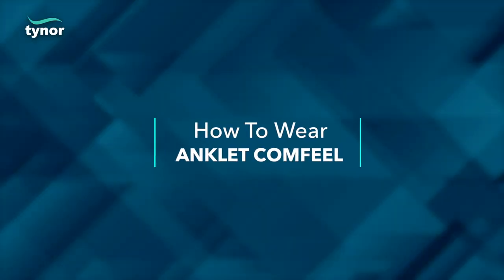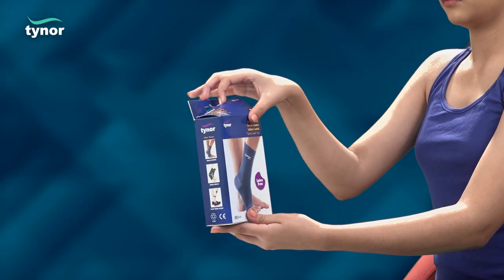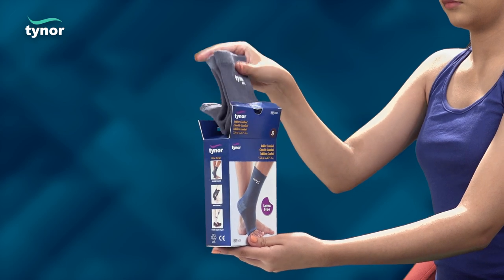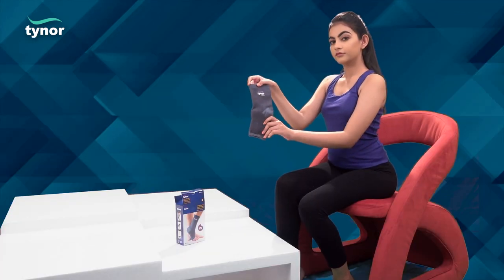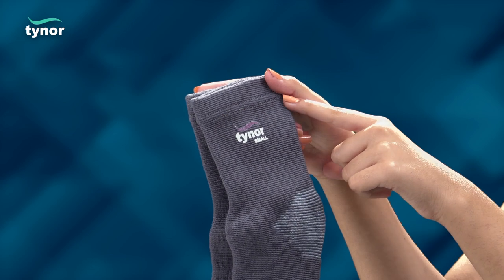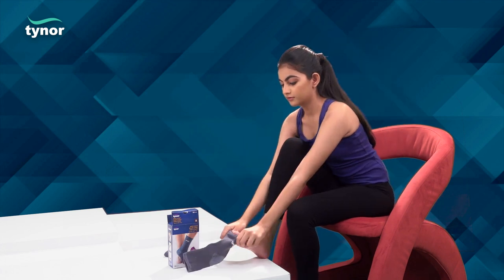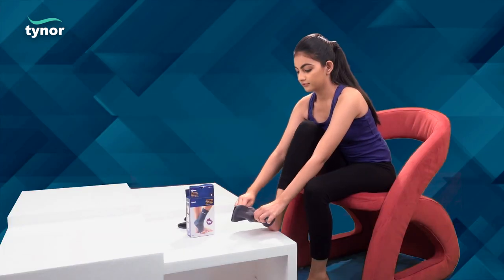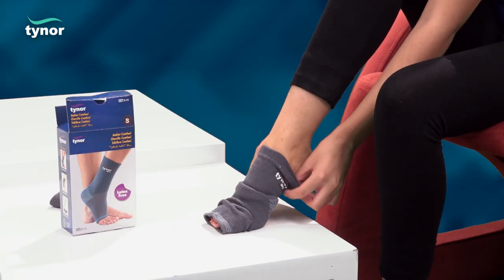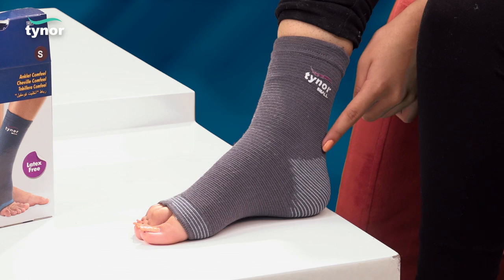Now let us see how to wear the anklet comfile. The longer and broader portion should be facing upwards. The product can be worn simply as socks with a pull-on action. The striped portion should be aligned around the heel for a perfect fit.